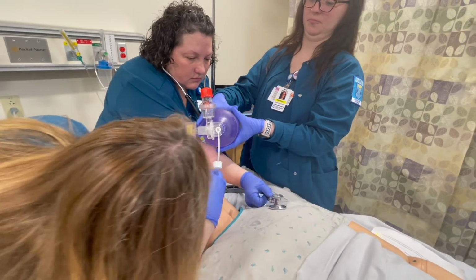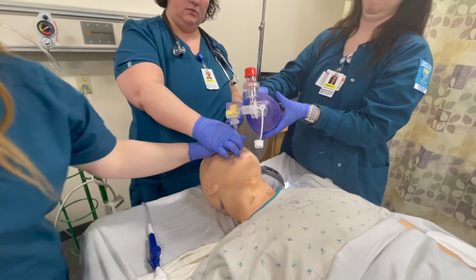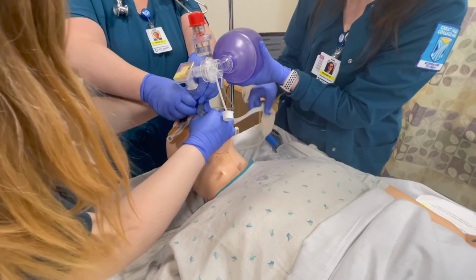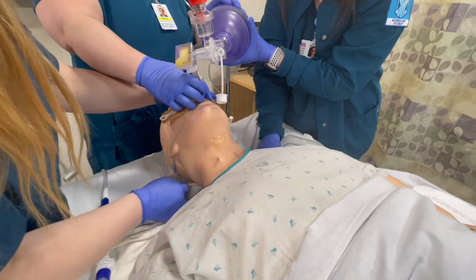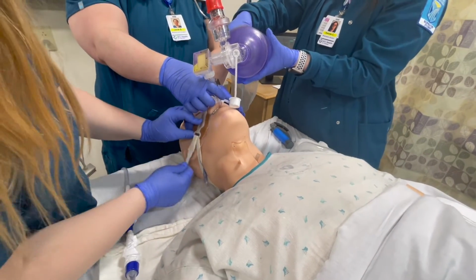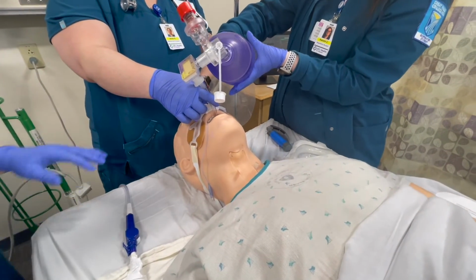So again, just to confirm, we do have 24 at the teeth. We did not slip. Breath sounds are equal. Okay, we do again have color change. I'm going to go ahead and secure the tube. Holster is secure. I can get 2 fingers in between the straps and the patient. Tube secure.